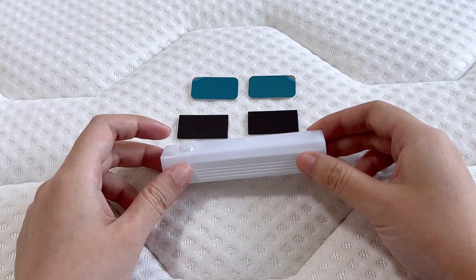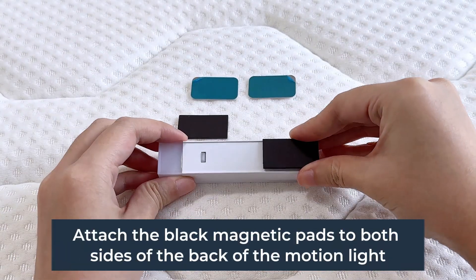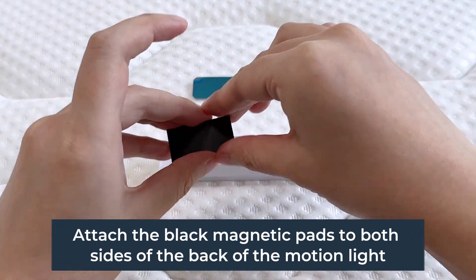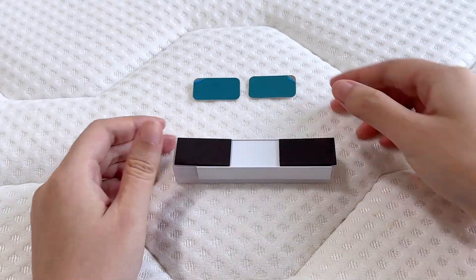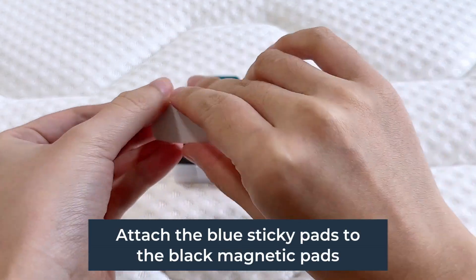Step 3 and Step 4: attach the black magnetic pads to both sides of the back of the motion lights, then attach the blue sticky pads to the black magnetic pads.